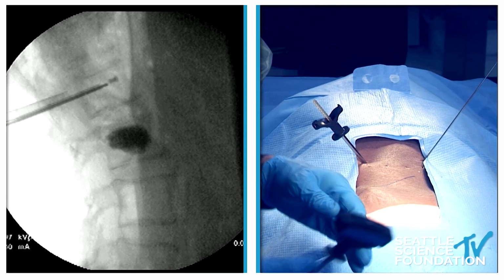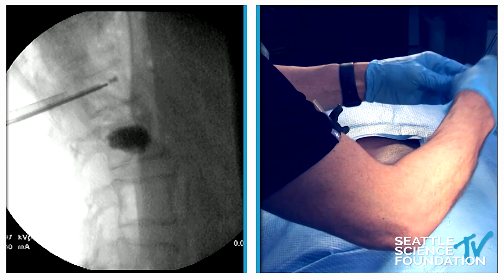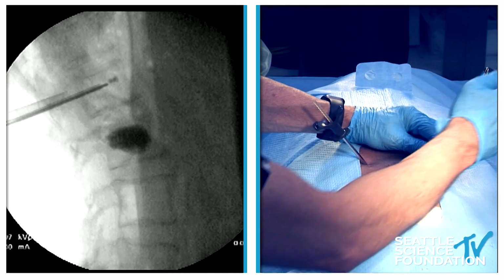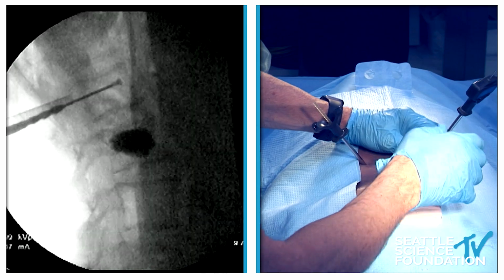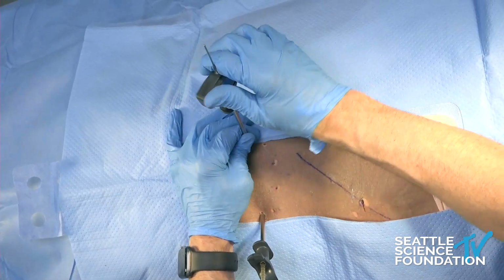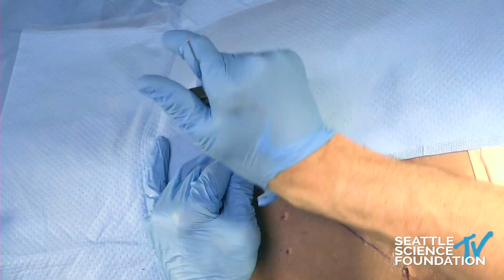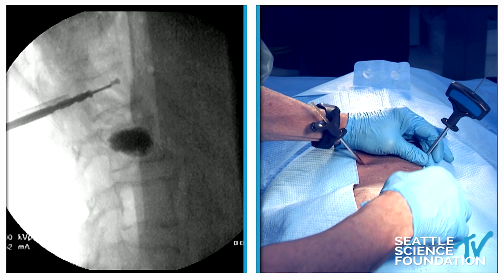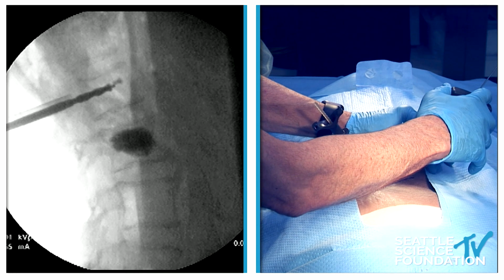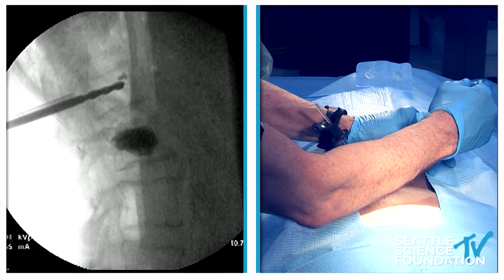Okay. So the biomechanics of the implant is based on a thing called a scissor lift. A scissor lift is something that's employed in all of the ports in the U.S. and around the world to transport freight. It lifts freight up, those storage boxes. Boeing uses a scissor lift to lift painters up to the side of the fuselage so they can paint the aircraft. And these skis on this device are the effector component of the scissor lift.